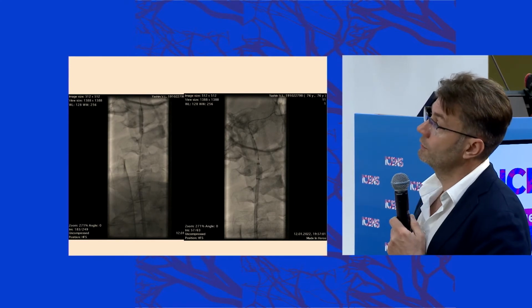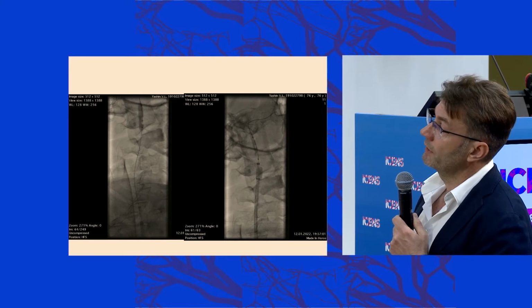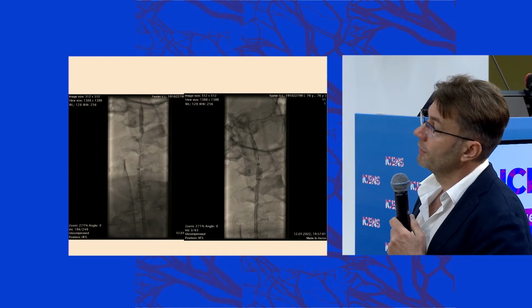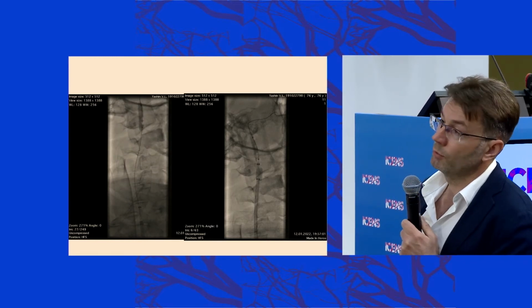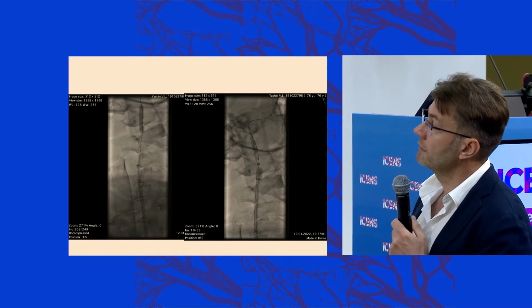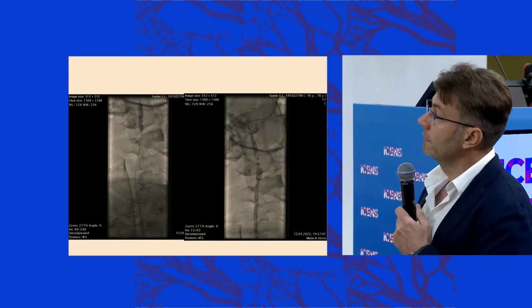Then it was inflated more distally, deflated on the occlusion catheter, and against continuous aspiration on the guide catheter, the aspiration catheter is moved further to the distally installed balloon, which constantly closes the blood flow in the ICA, minimizing the risk of distal embolia.